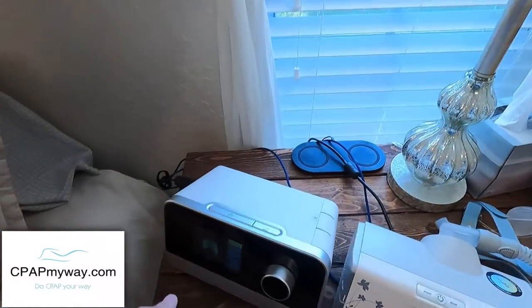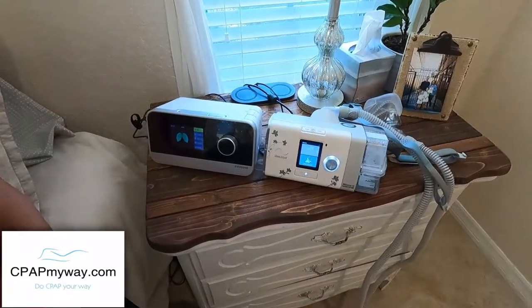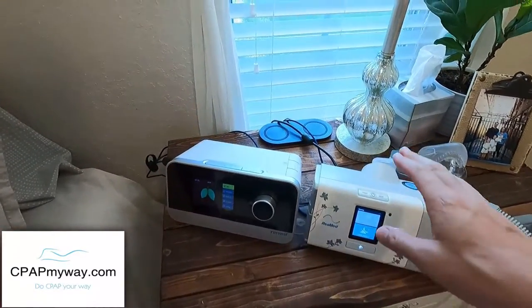So, pretty similar footprints on the nightstand. Darn near identical there. And we're going to leave the AirSense plugged in just in case we have a midnight panic attack and we need to switch back. I'm sure it'll be fine. So hang with me here. I'm going to let her film. We're going to put the exact same settings in both machines.